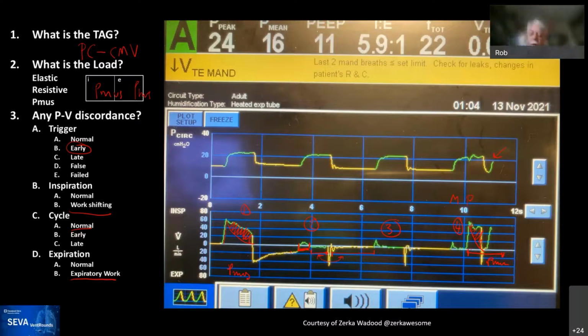And what that means is, in a situation where a patient can exhale during a mandatory pressure control breath, then the ventilator does not display the correct exhaled tidal volume. It could be much less than it really is. So if you're ventilating somebody and you see an expiratory tidal volume of say 8 mLs per kilogram, you say, well, I'm still safe. But it could actually be much higher than 8 mLs per kilogram, and you would never know.